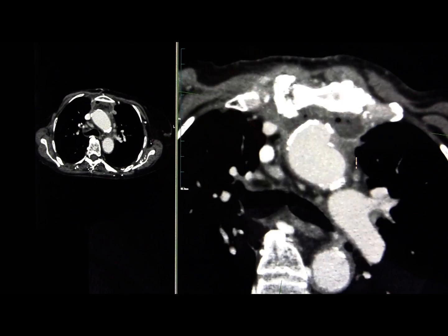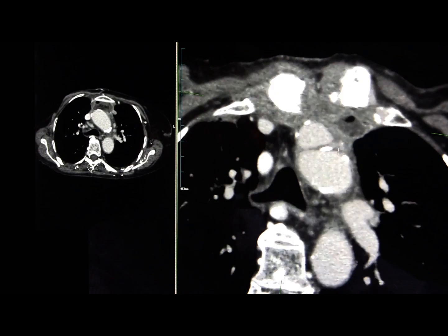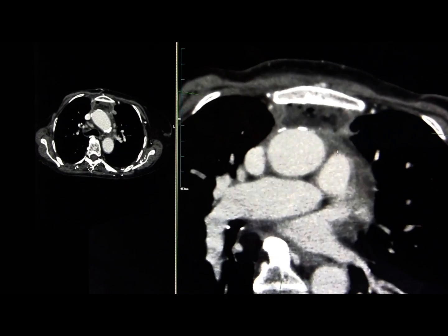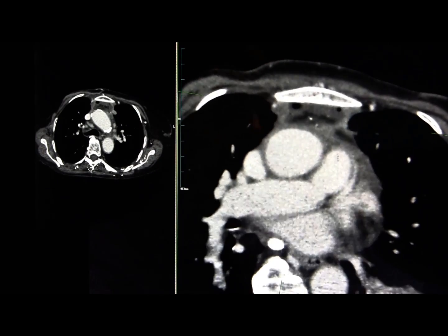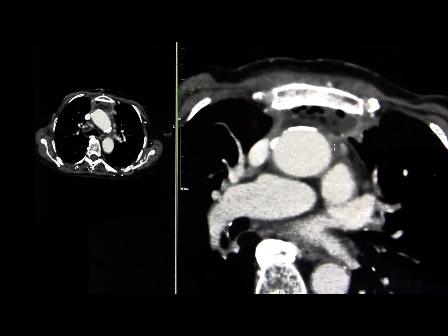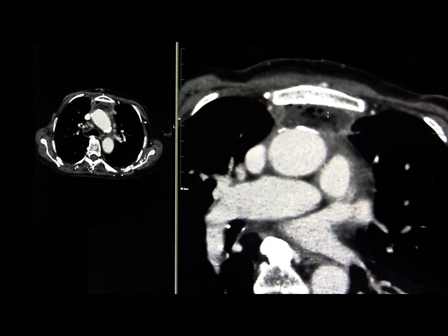This lady has sepsis. She's got a septic joint here at the sternoclavicular junction, and she's got an abscess which is tracked down behind her sternum. She's not very well, and at the age of 71, the cardiothoracic guys are not particularly interested in her, so they've asked us if we can get a drain into this collection behind the sternum.